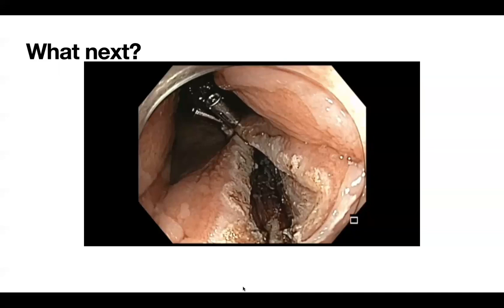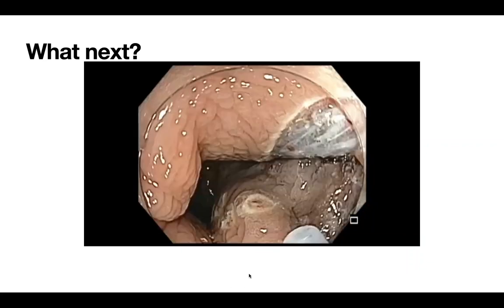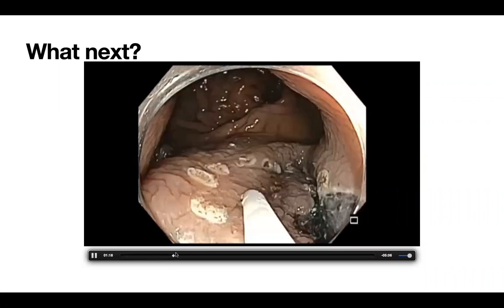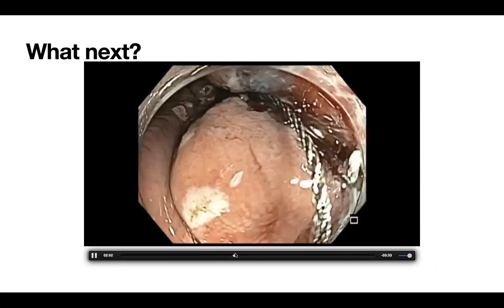I was surprised that you allowed the technician to have like 2 millimeters of the flat straight wires out from the plastic, because when you do that, the snare loses its strength and can deflect upward very easily. So that is one of the potential reasons. Other than that, I think it was a complete cut, and we want to know what the pathology is.